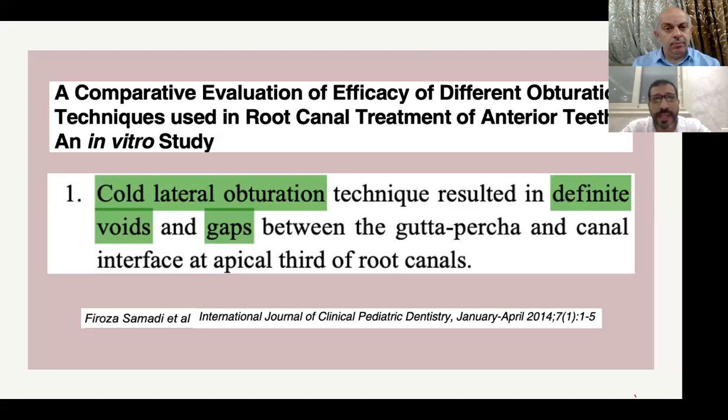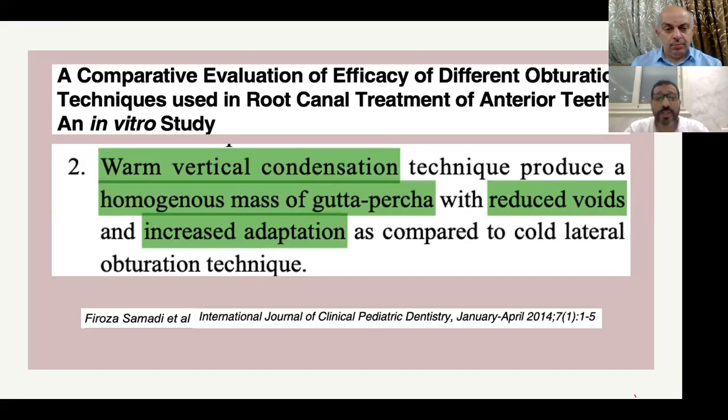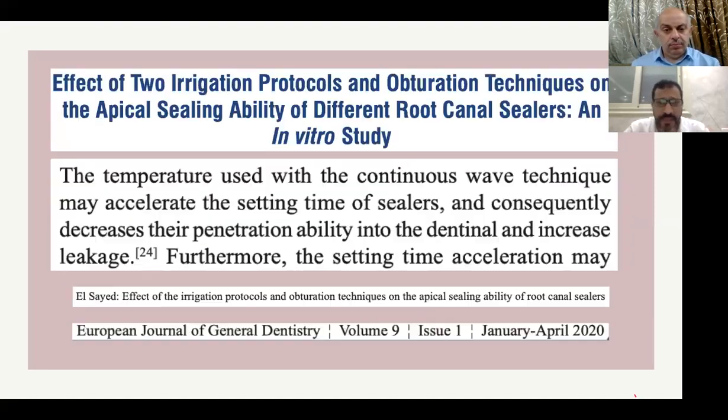Actually, regarding the obturation technique, the warm vertical compaction technique is better than the lateral compaction technique. Even though we used lateral compaction for many years, nowadays we are using warm vertical compaction as the standard for root canal obturation to overcome the gaps and voids that we saw in lateral compaction obturation. Warm vertical compaction has a homogeneous mass of gutta-percha with reduced voids and increased adaptation. The temperature with the continuous wave technique may accelerate the setting time of the sealer.